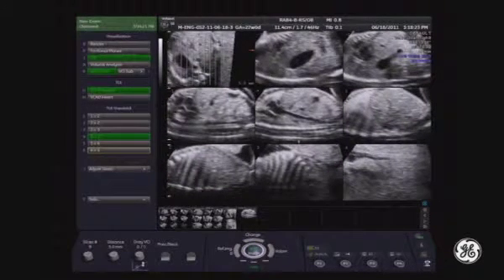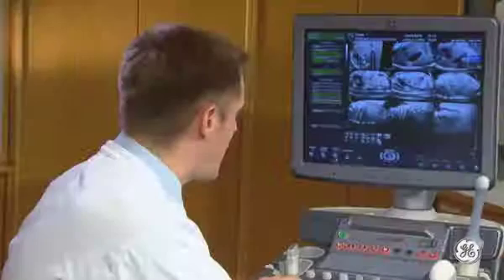Let's magnify it and let's follow the relation between the diaphragm and the abdominal organs. Here you see the stomach, and you see that the course of the diaphragm is here. Here the same. Here you start seeing the liver, and this is the confluence of the systemic veins towards the right atrium. And this is the right side of the diaphragm with the liver on your right.